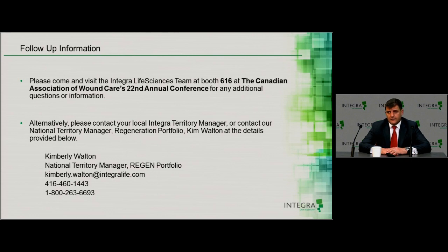in the trial. For venous leg ulcers, we use IDRT under compression, and for inpatient hospitalization with IDRT applications greater than 40 square centimeters, we almost always use negative pressure wound therapy as a 4-day bolster. Okay, and there was just the last part of the question: how often do dressing changes need to be done? I knew I'd missed one part of it.